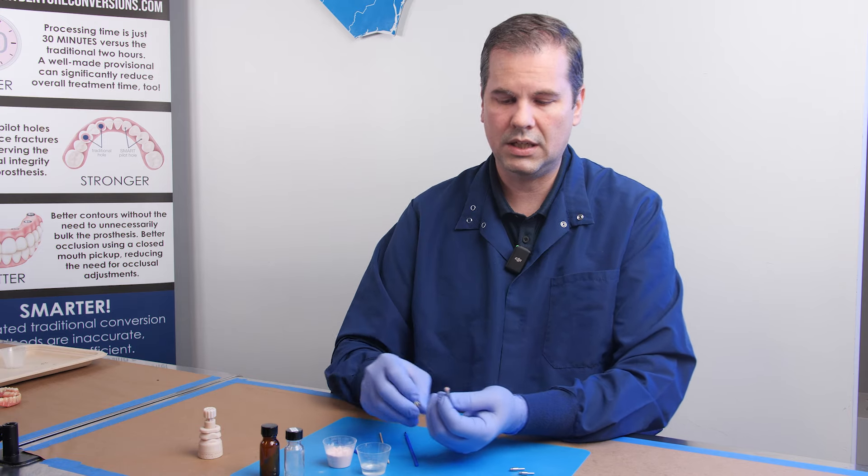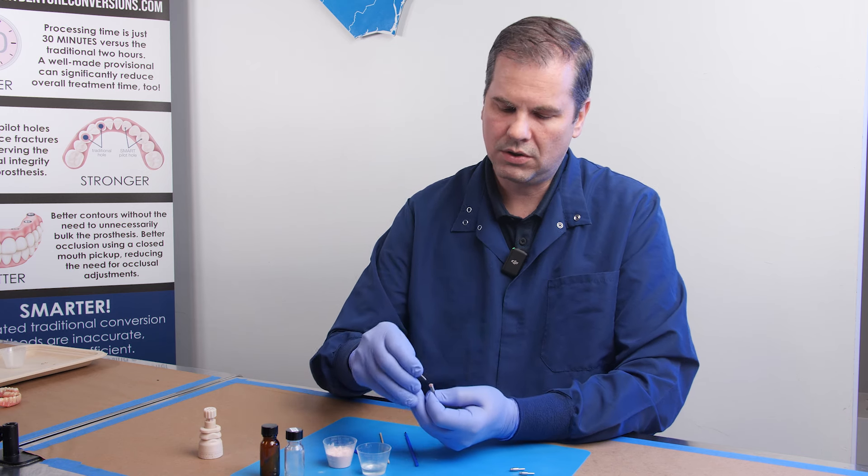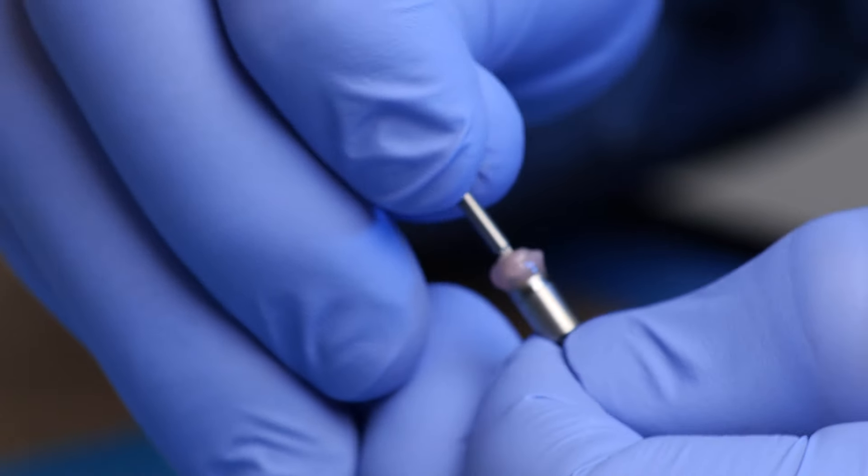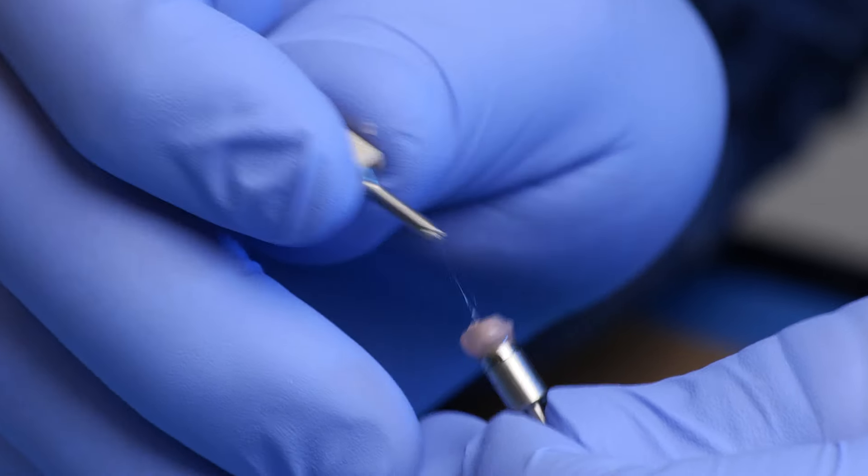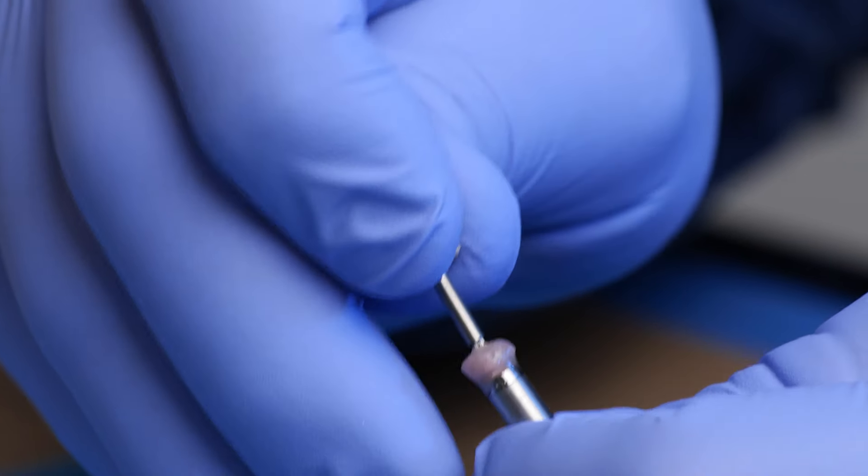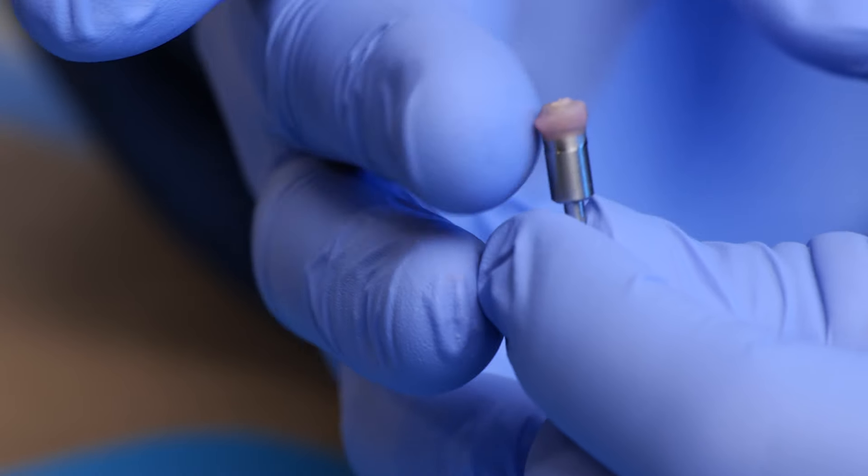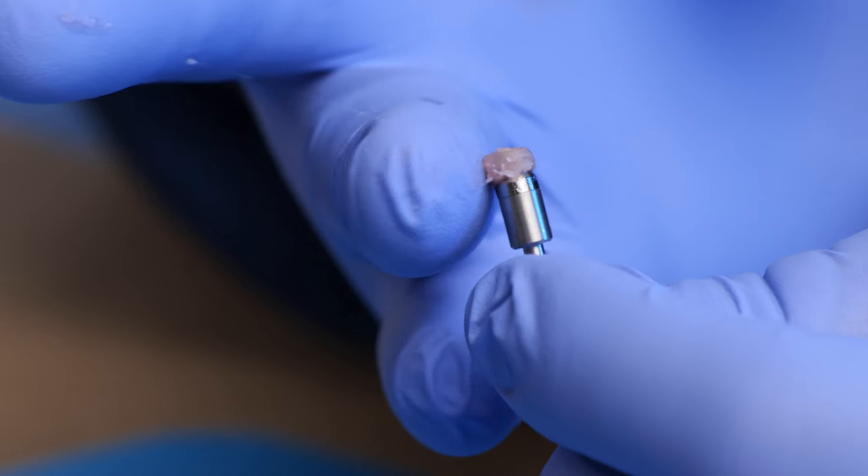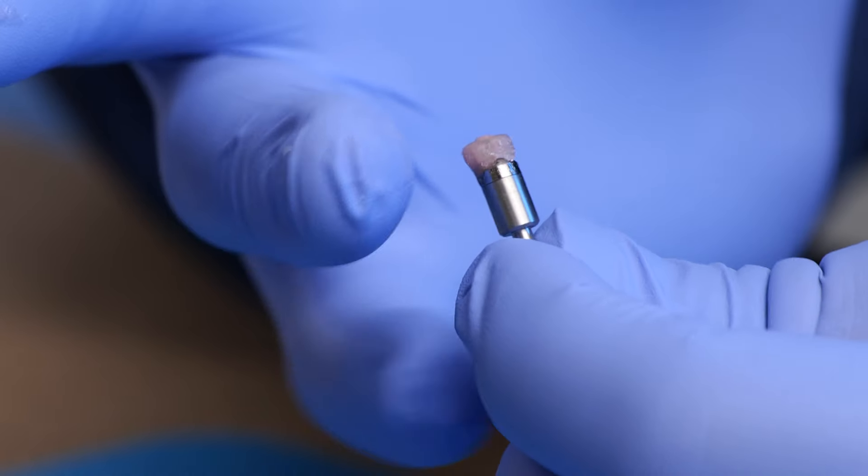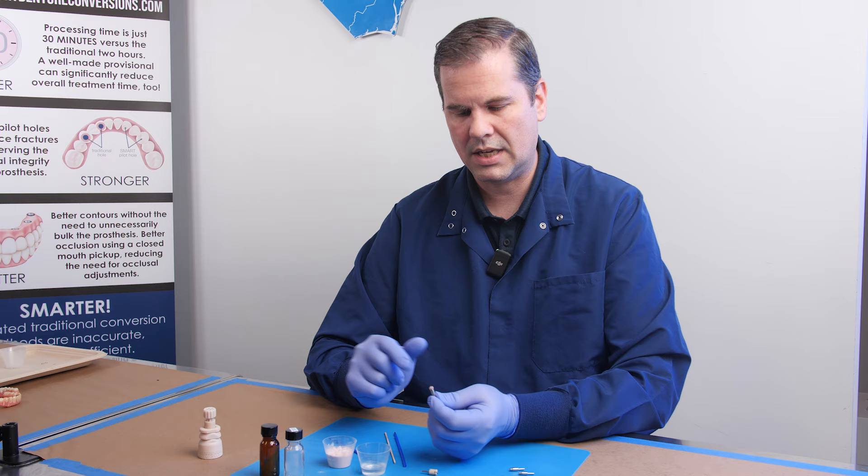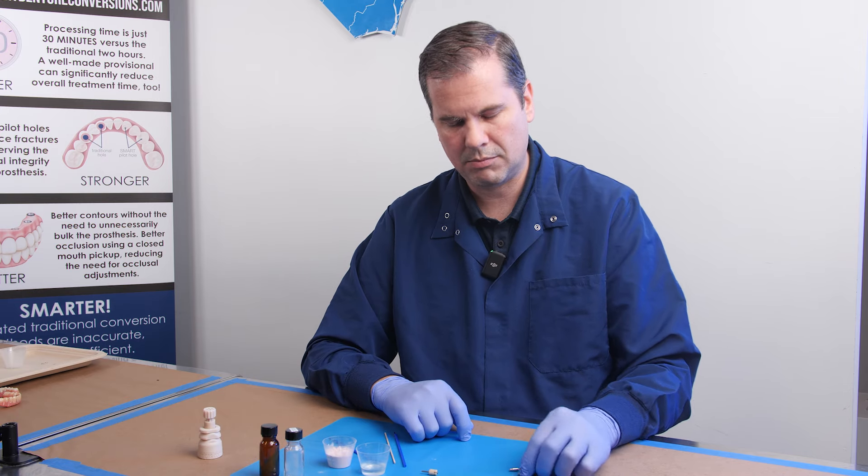Here, if you wanted to, you could plunge that drive feature to get the acrylic out and preserve access to it. But it's not critical that you maintain access to that drive feature, and you'll see why in subsequent videos. So that's pre-coating method number two.